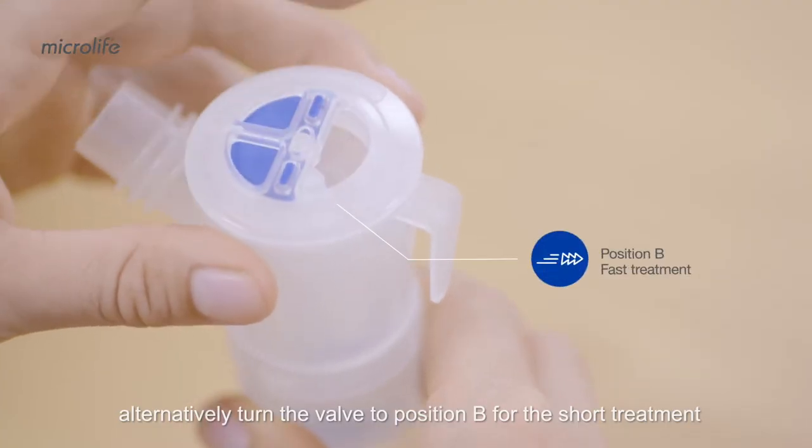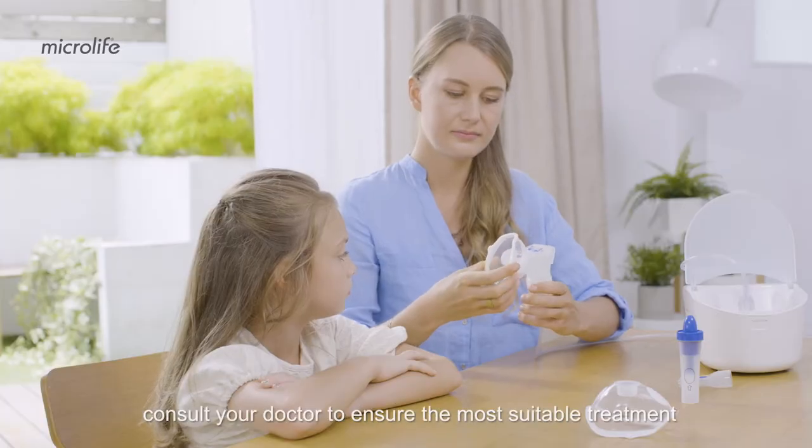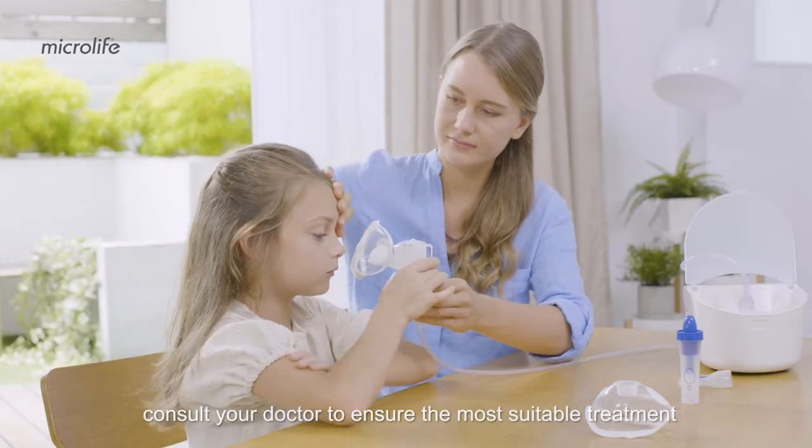Alternatively, turn the valve to position B for the short treatment. This option can be done with either a mouthpiece, mask, or a nosepiece. Consult your doctor to ensure the most suitable treatment.